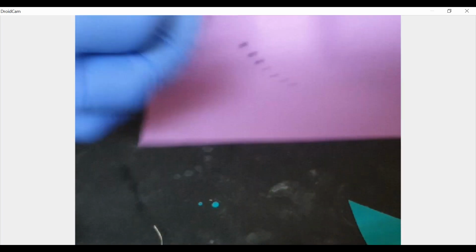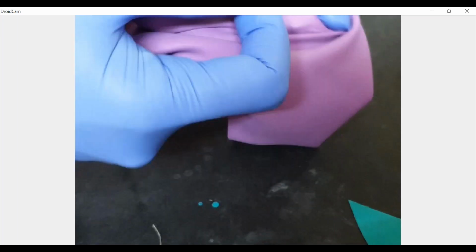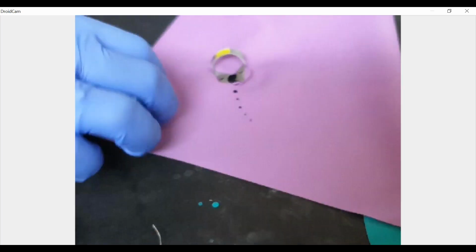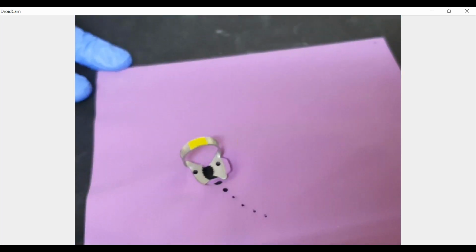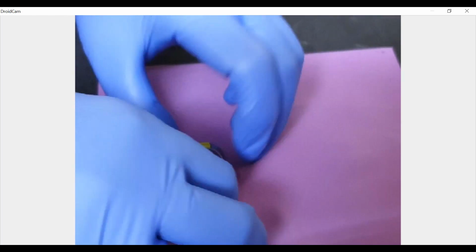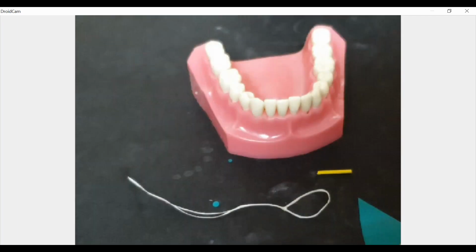Again, you already know how to engage the wings. Stretch it slightly. See, this has amazing elongation. It has more than 950% of stretching ability. The most important thing is you have to keep this parallel. See, this is not parallel. So I'll have to readjust it here so that it becomes parallel. Now it is parallel. So then we will move ahead with our isolation.